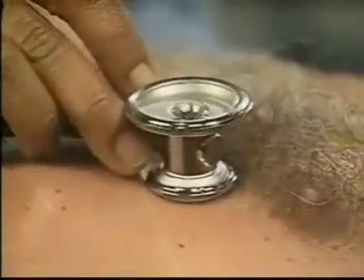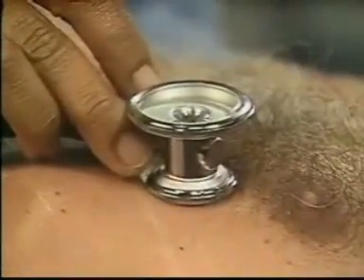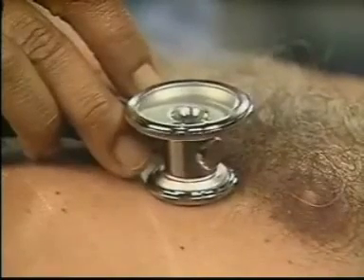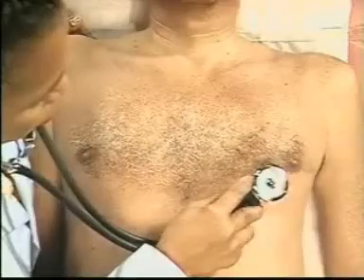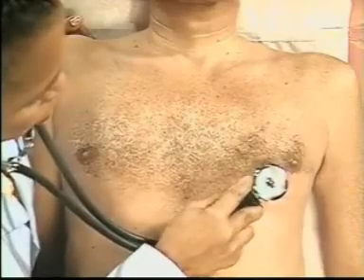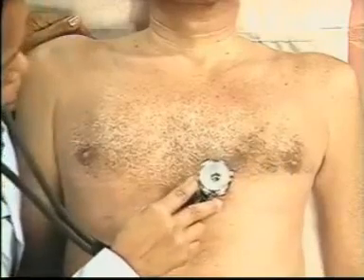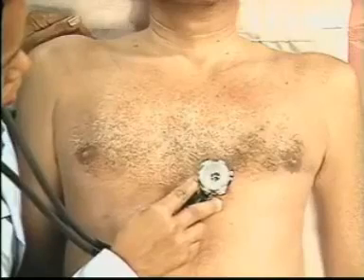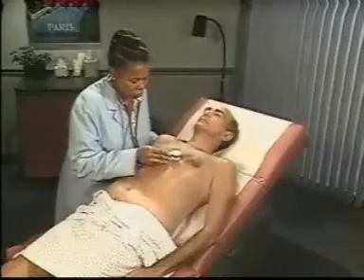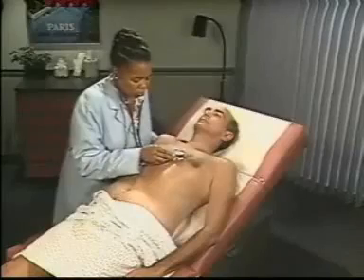Now switch to the bell of the stethoscope, which is more sensitive to low-pitched sounds, such as S3, S4, and the murmur of mitral stenosis. Listen at the apex again. In the fifth interspace, and in the fourth interspace.